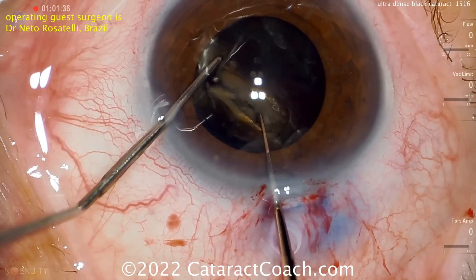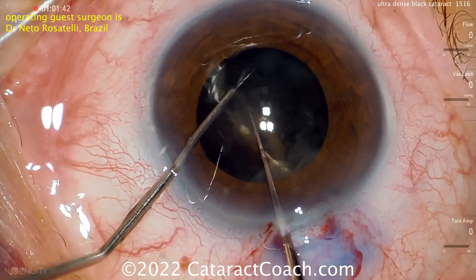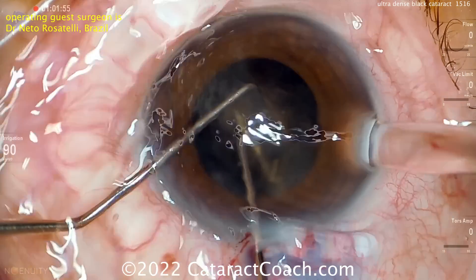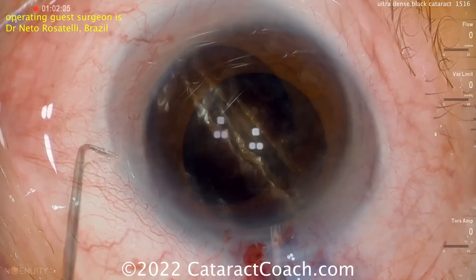This requires a lot of force. You can't just use the 500 millimeters of mercury of holding power from the phaco probe — you're actually trapping the nucleus between the hook in the left hand and this sharp chopper in the right hand. Notice this sharp chopper — the leading edge of it is sharp.